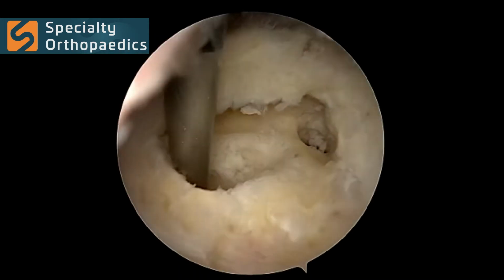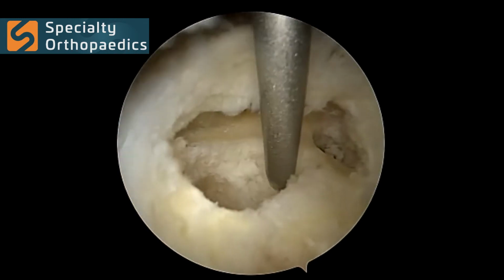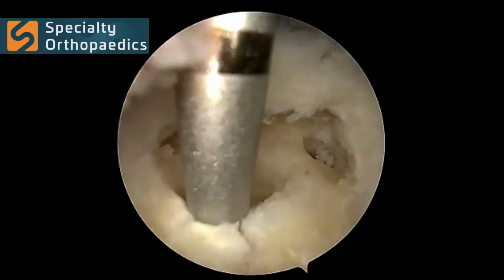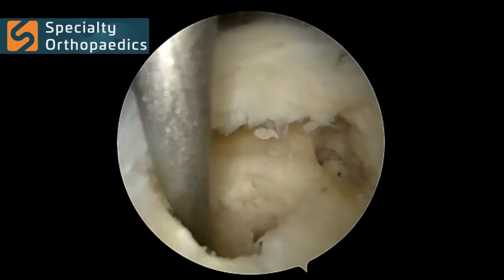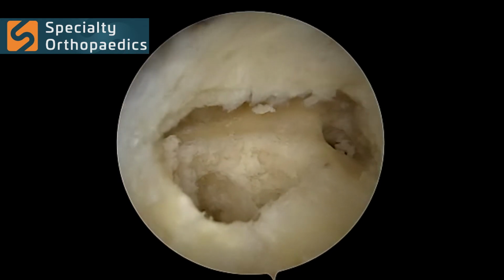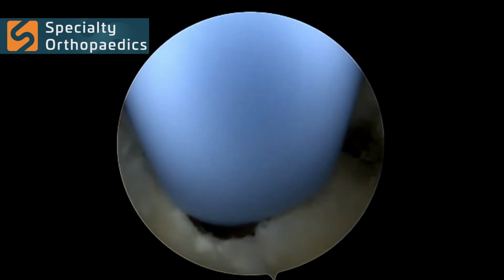In addressing this issue, we first address the lesion by preparing the lesion using a ball tip rasp to remove any fibrous tissue and using a small punch for marrow stimulation. While preparing the lesion, I'll have my assistant prepare crushed cancellous bone graft by morselizing the pieces into smaller fragments and then inserting it into a 5mm cannula.